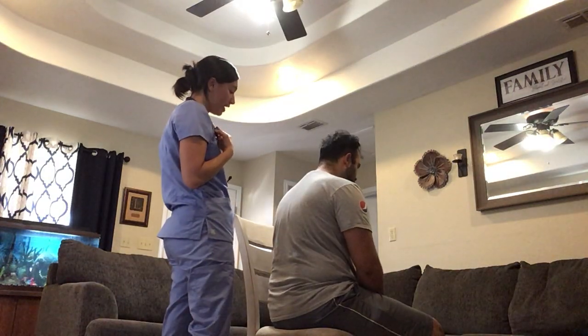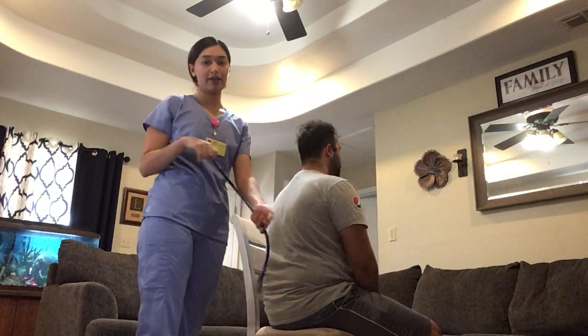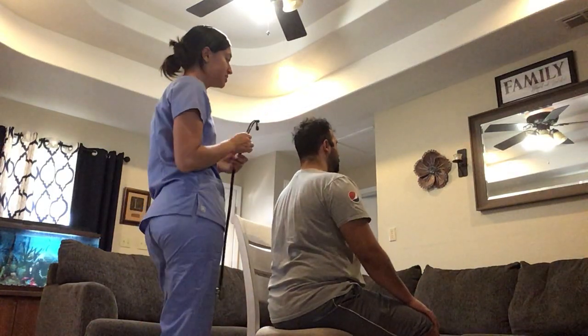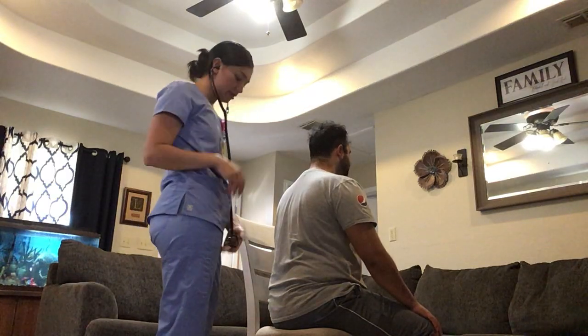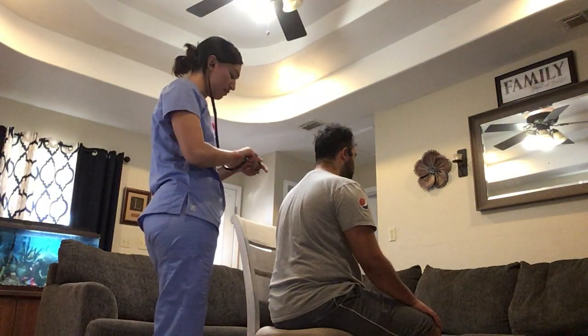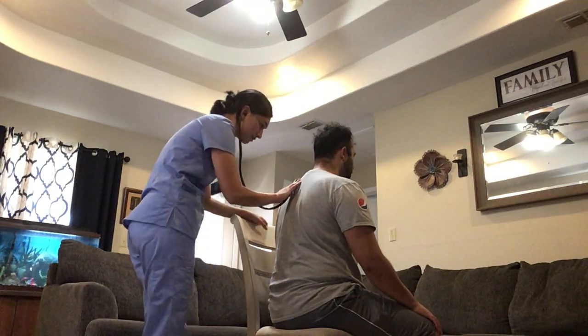Now I'm going to auscultate. I'm going to hear his lung sounds. I'm going to ask him to take a deep breath through his mouth for me, okay? And I will be using the diaphragm of my stethoscope. Okay, can you go ahead and take a deep breath for me, please?